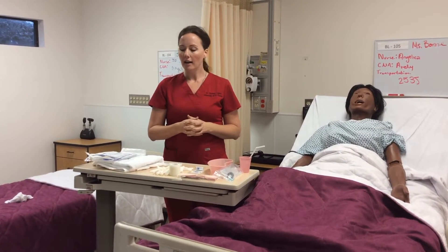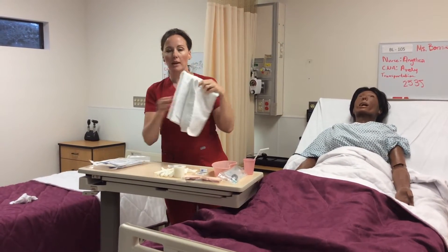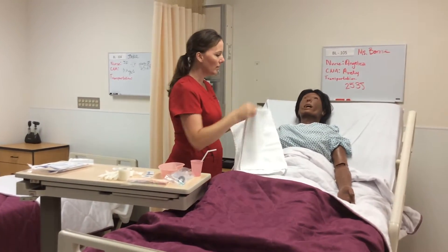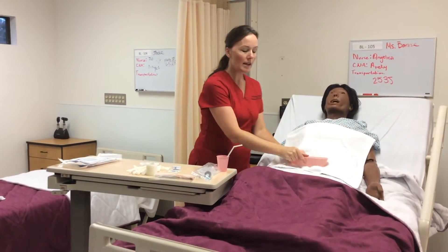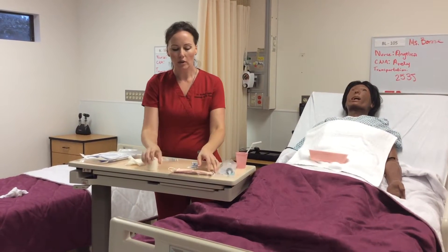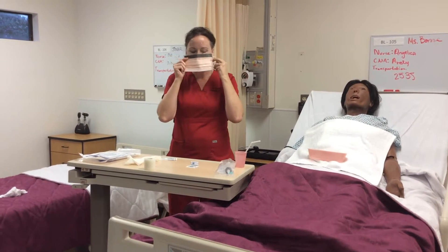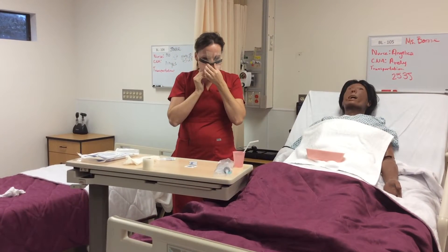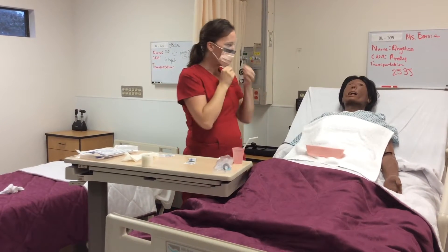Note that this could be a gag reflex inducing procedure, so I will apply a towel to the patient's chest area and a kidney basin. It is a clean procedure, so I only need clean gloves. I will also apply a mask with a shield, just in case there is any vomiting.